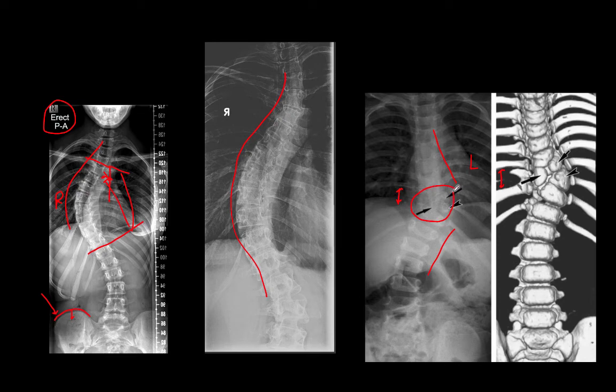This is a perfect patient who should get a CT examination to figure out exactly what type of anomalous development is happening in their spine. Turns out this patient has a butterfly vertebra up top and a hemivertebra followed by an oddly shaped vertebra. And these are responsible for the acute left-sided, or levoconvex, thoracic scoliosis. So this patient has structural scoliosis. Adjusting is not going to help correct their curvature. It may provide them with symptomatic relief, of course, but in terms of management, they're really limited in their spinal alignment-based prognosis.